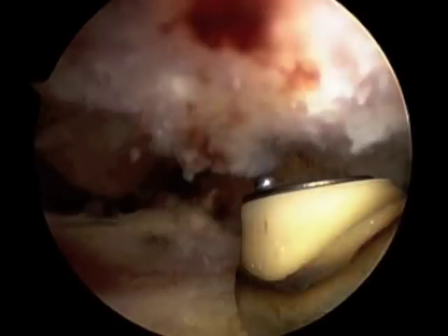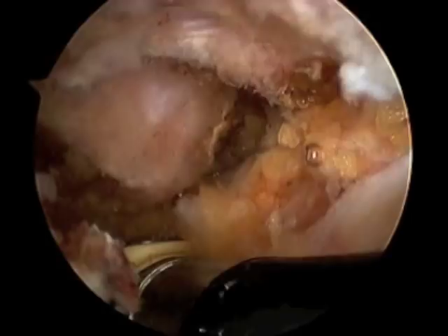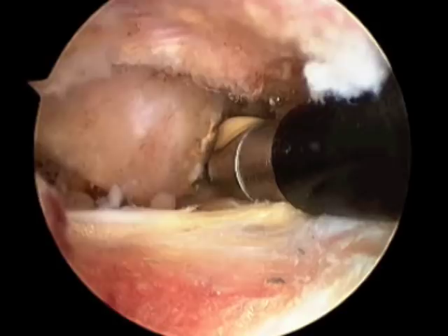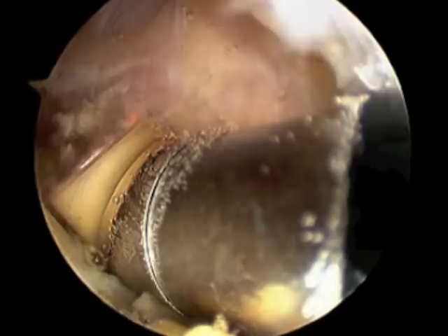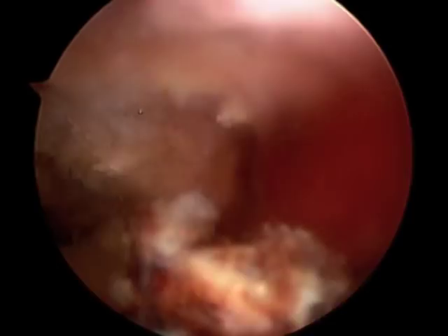In the normal healthy state, the end of the collarbone there should be covered in nice, white, smooth articular cartilage. This patient has lost almost all of his articular cartilage. There is bare bone visible on the end of the collarbone, and this would be a very painful joint.